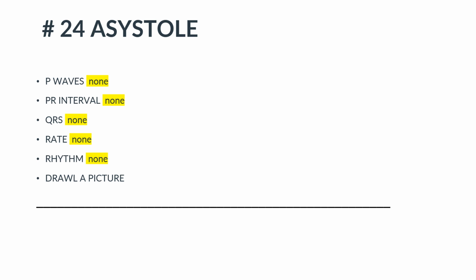All right. When you see this in reality, you're doing three things. Number one is, you're confirming that this is real, right? So this is just like VFib. You're going to see a lot of asystole. And so you're going to run to the room, check up on the patient, and the patient's like, hey, how you guys doing? Okay, that's not real, right?